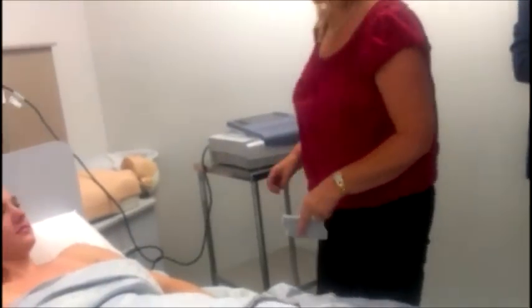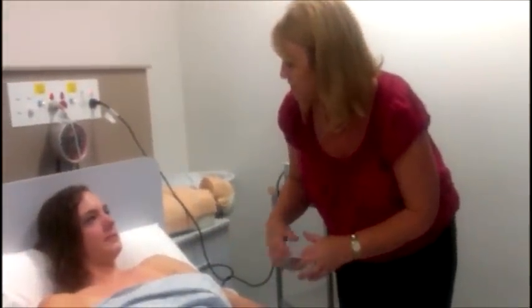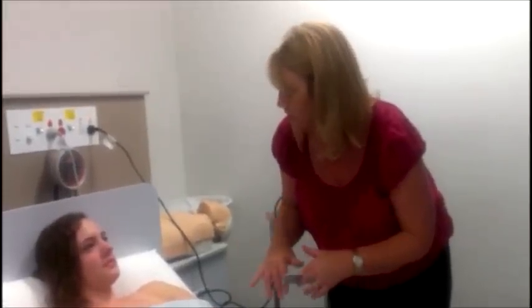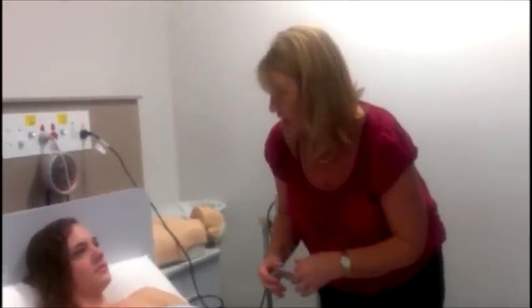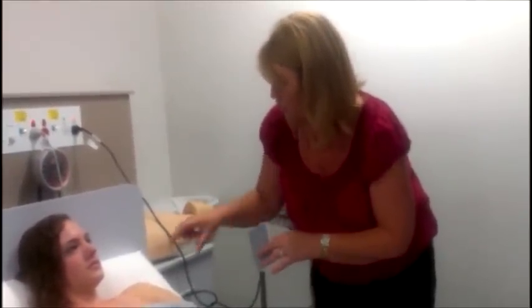So Emma, the doctor just wants us to do a cardiograph, which is just looking at the electrical part of your heart, which helps to make your heart pump. It's not actually looking at the pump side, just to see if that's all normal. It's just a routine procedure. I'm going to put lots of sticky leads all over your chest and around your heart so that we're looking at all the parts of your heart.